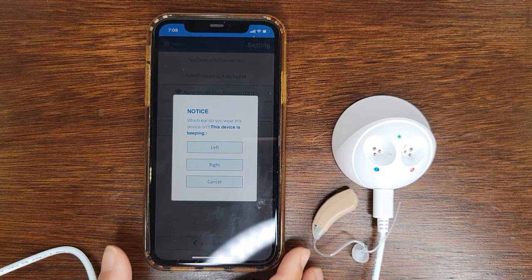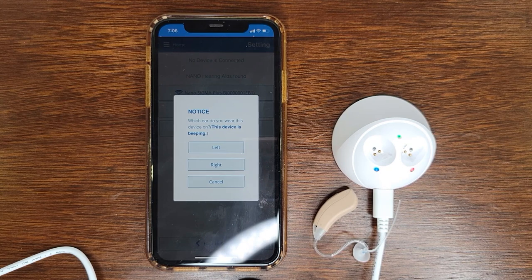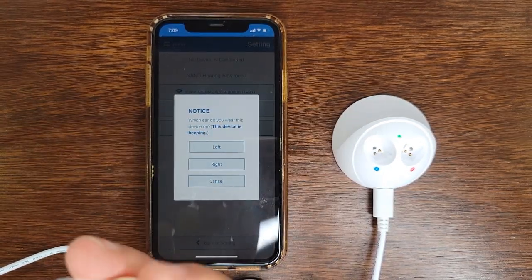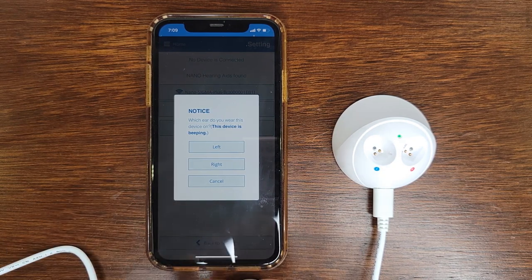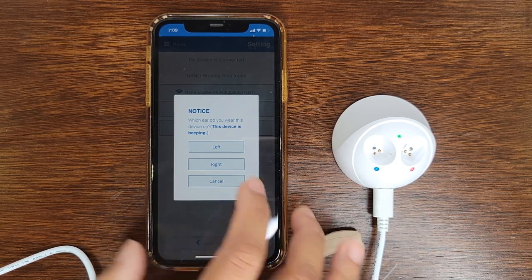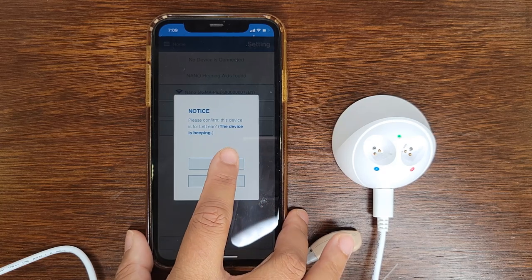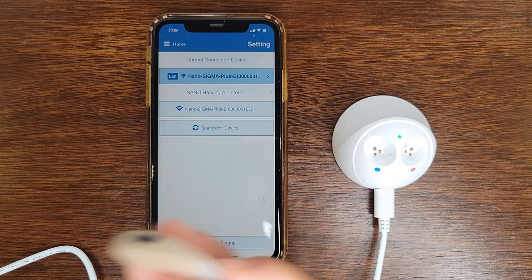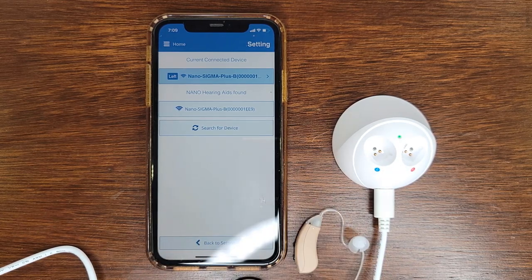So once it's connected, it does give you this notification. So we're gonna try to adjust which ear this is for, and you can let the app know if it's for the right or the left ear. Yes. So you're gonna hear a beeping sound from the device when it's turned on. And let's do the same for the other one.